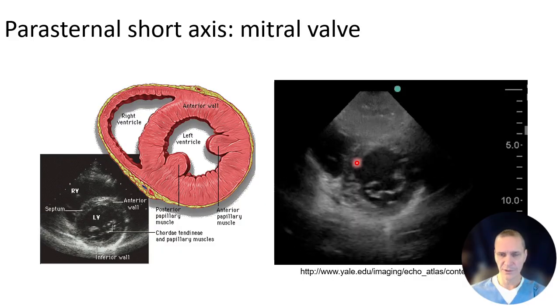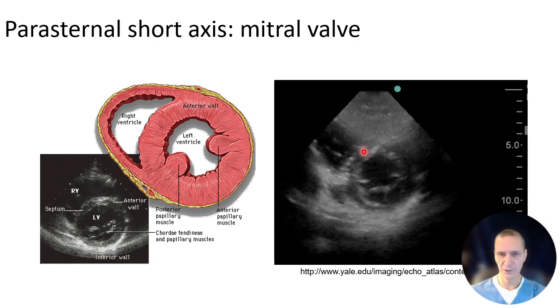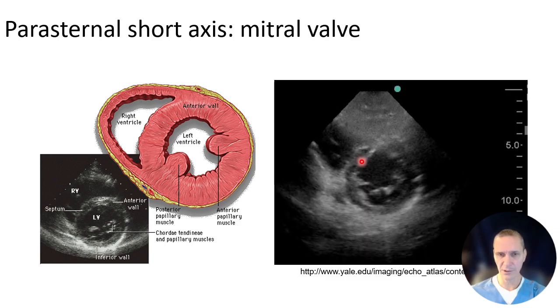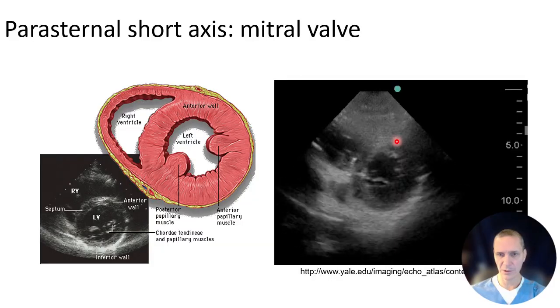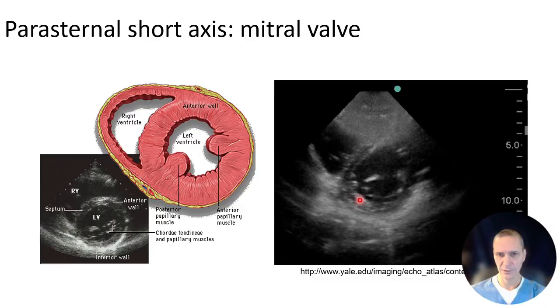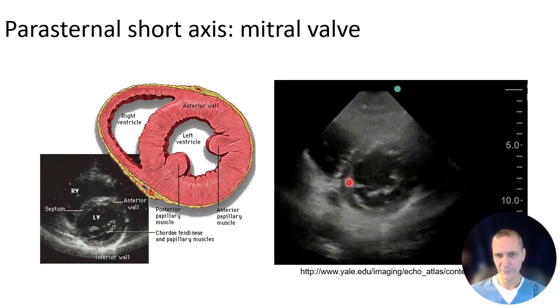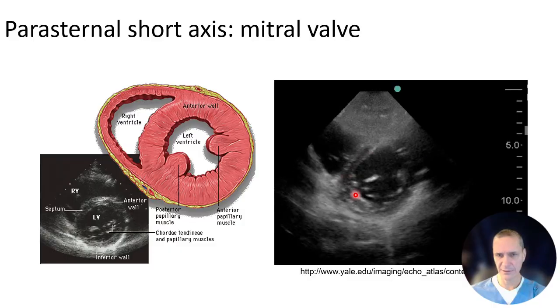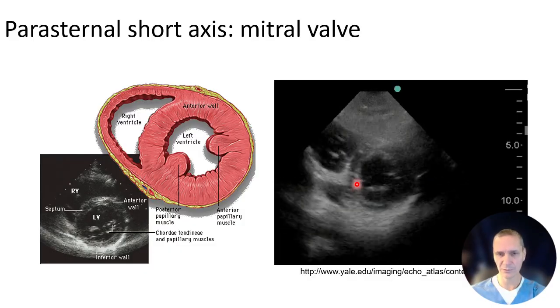As your ultrasound skills improve, with this view, you can look at the particular walls of the heart. So this would be the septal wall, the anterior wall, the lateral wall, and the inferior wall. This is the mitral valve here. And when you're first starting out, you're not assessing this. You're kind of just looking at size and global general function.